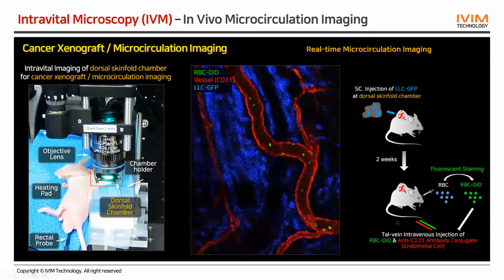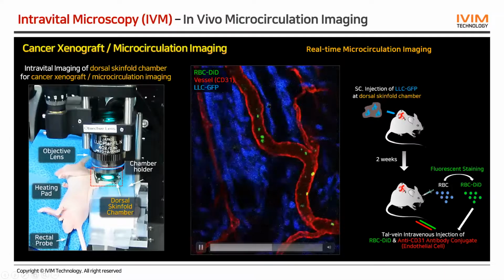And then you can directly see how fast the red blood cell flow is in the vessels inside this tumor. In the middle, you can see this distorted blood vessel in the tumor. And on this left side, you can see this sluggish, very slow red blood cell flow in the vessel, which is due to the collapse of the blood vessel due to the proliferating cancer cells.